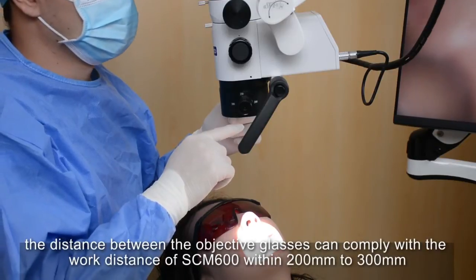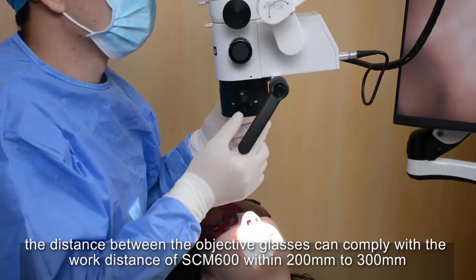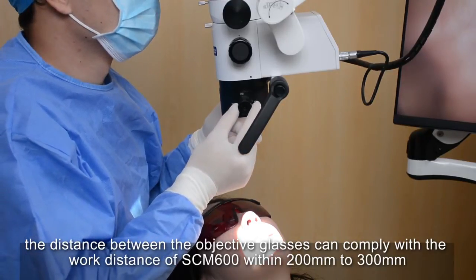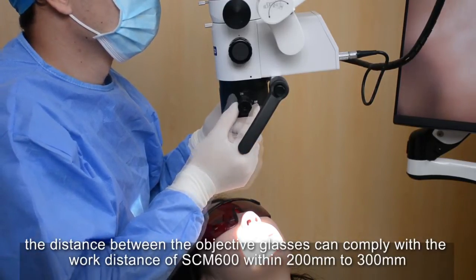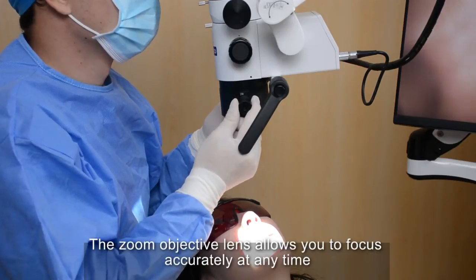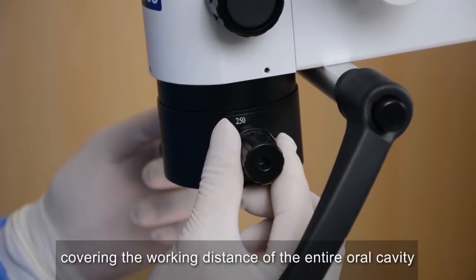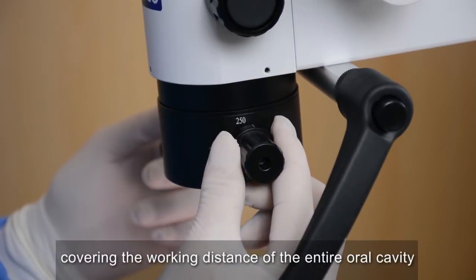The distance between the objective lenses can comply with the working distance of the SCM600, within 200mm to 300mm. The zoom objective lens allows you to focus accurately at any time, covering the working distance of the entire oral cavity.